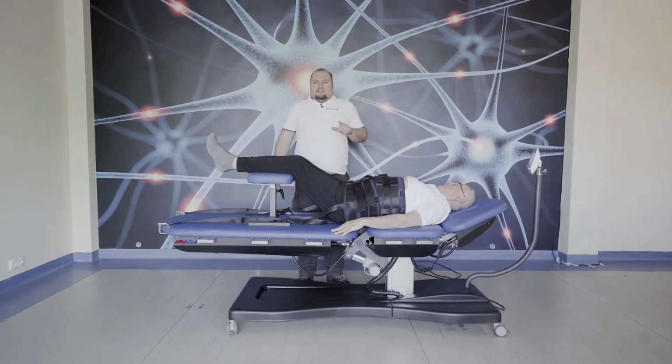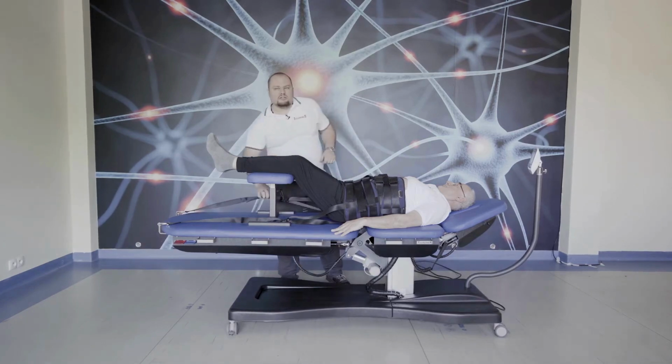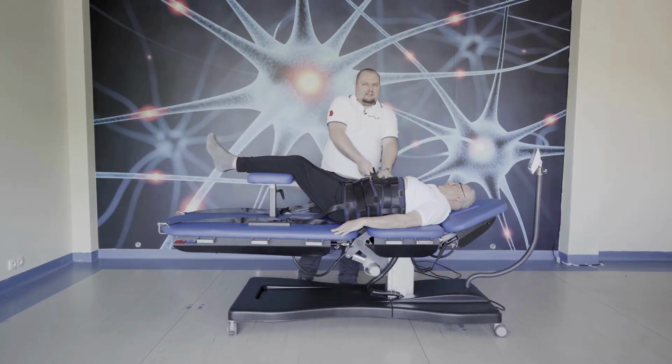When you have the patient in a good position, we should go for the next steps. So take all the slack from the strips, close the belts tight, and start traction.